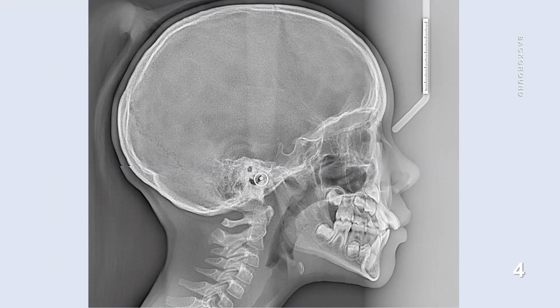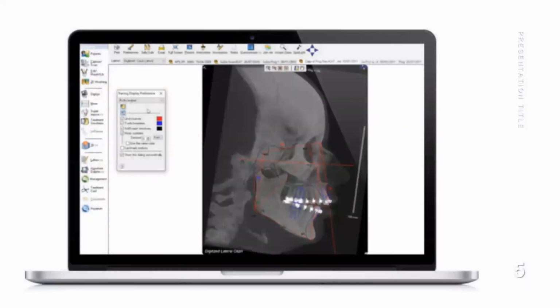Lateral cephalograms are also relied upon by the researchers guiding advancements in the field because cephalometric analysis is a key tool to study dental and skeletal development, outcomes, and the relationships dental and skeletal characteristics have with factors such as genetics or the environment. To standardize their interpretation, orthodontists and oral surgeons have identified several key landmarks along the skull and soft tissue profile and extract information from the angular and linear measurements between them. Originally, all of this was done by hand, but now software exists that calculates the relationships between landmarks once identified.